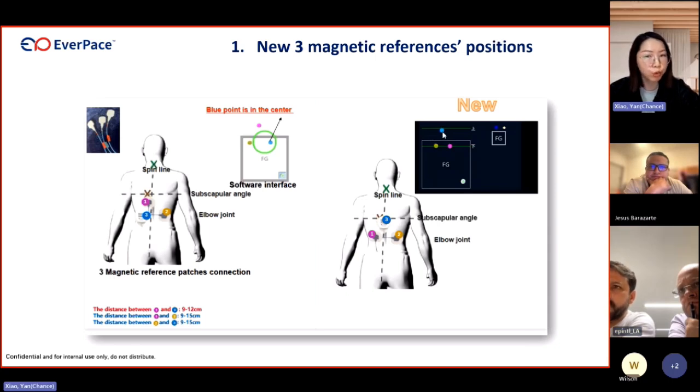Make the blue point close to the first green line. For the other two patches, there's no sequence. We will reuse the sensor from the EPU and also a white foam to fix these two patches. We just need to modify the Columbus external patch as the picture showed. You should make it much closer to the heart. It will make our geometry much more stable.